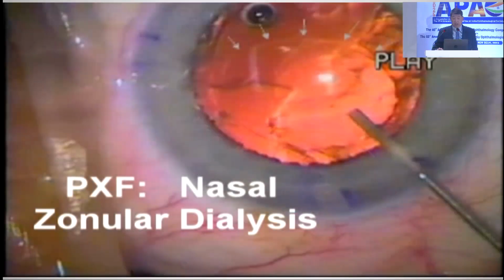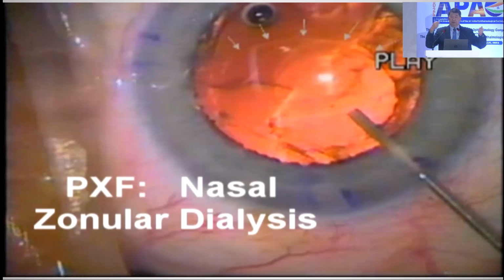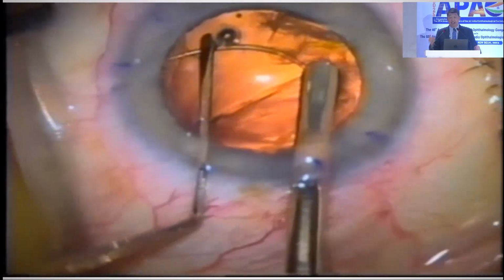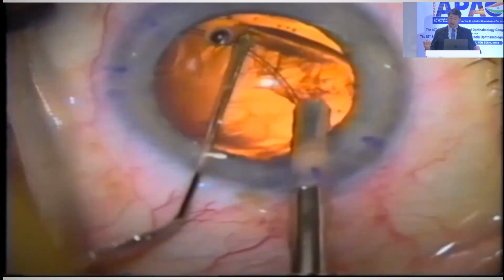All right, so now here's a case where I inadvertently grabbed the anterior capsule and I've created a 3 clock hour dialysis nasally on a pseudoexfoliation patient. So similar to this case, I think all I need to do is put in a CTR, right? So again, I'm just doing my cortical, oh my gosh, I created a dialysis. So what, 3 or 4 clock hours, and I know I want to try to bend the haptic, and it's kind of like this case.